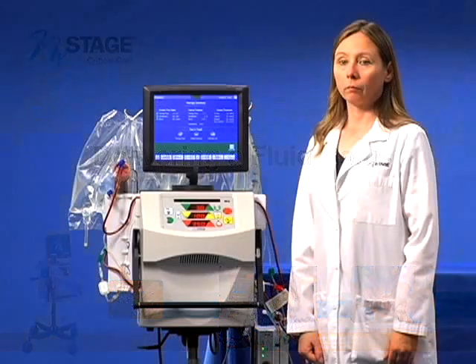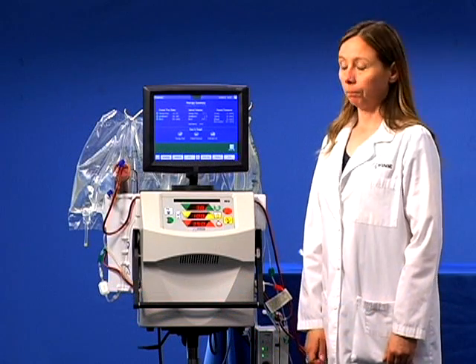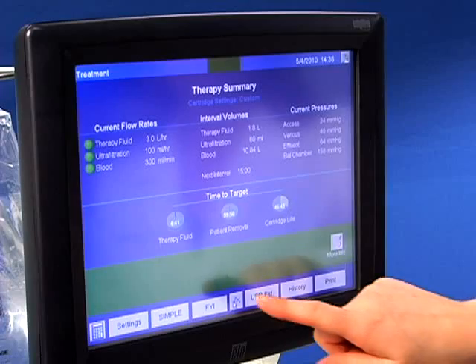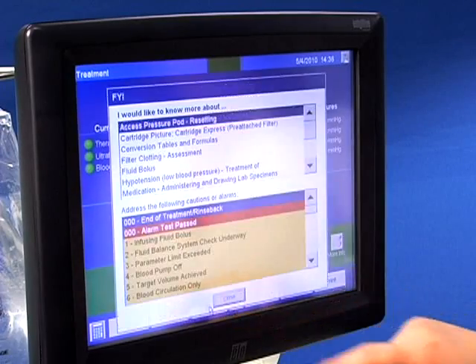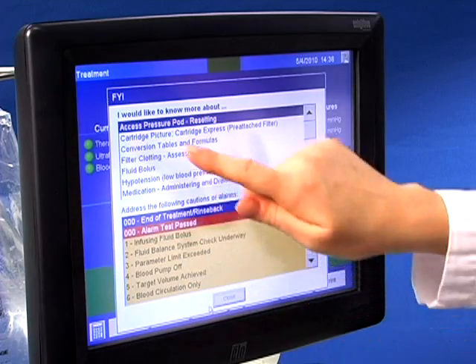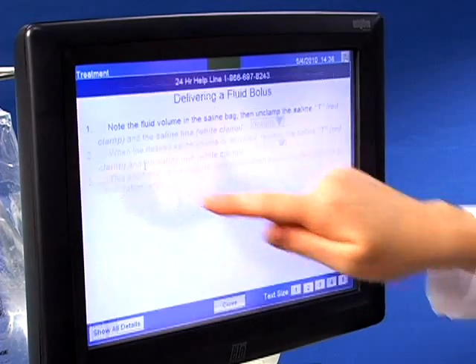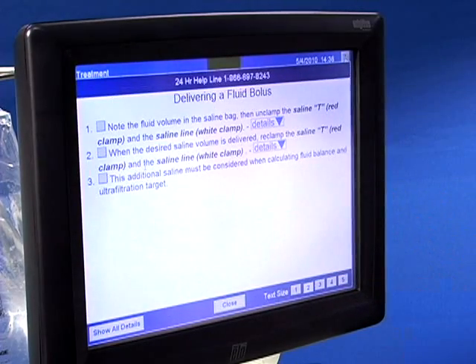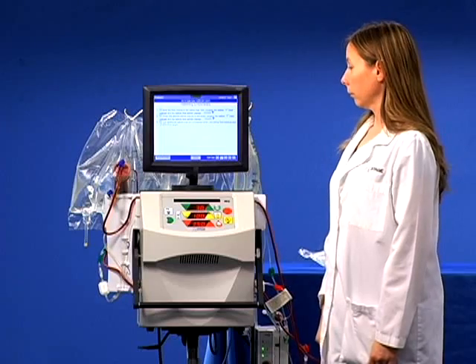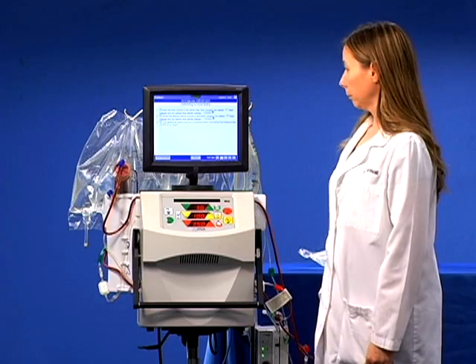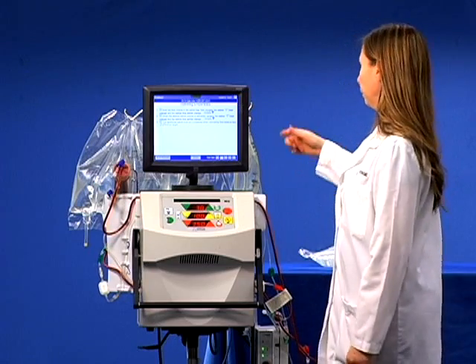Access the instructions in FYI. Note the fluid volume in the saline bag.